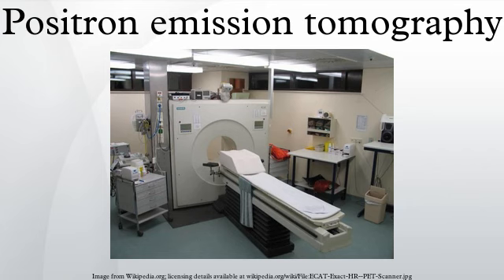Neuropsychology/cognitive neuroscience, to examine links between specific psychological processes or disorders and brain activity. Psychiatry: numerous compounds that bind selectively to neuroreceptors of interest in biological psychiatry have been radiolabeled with C11 or F18.